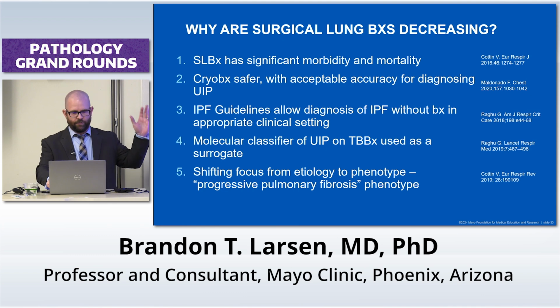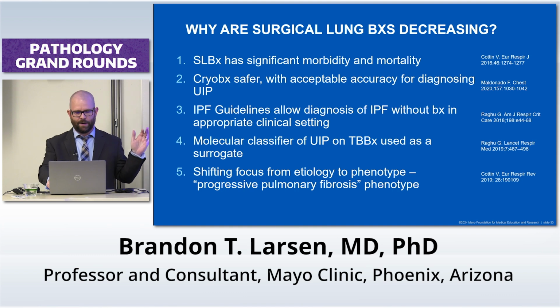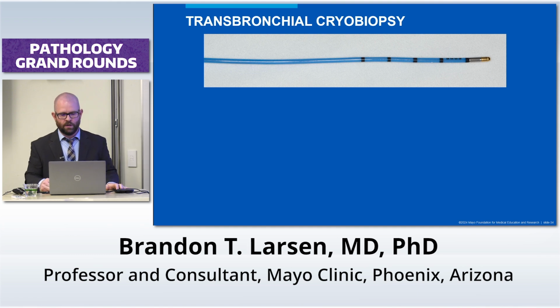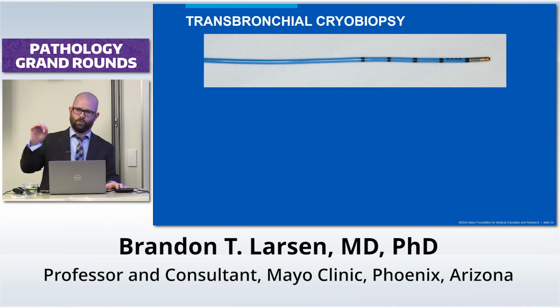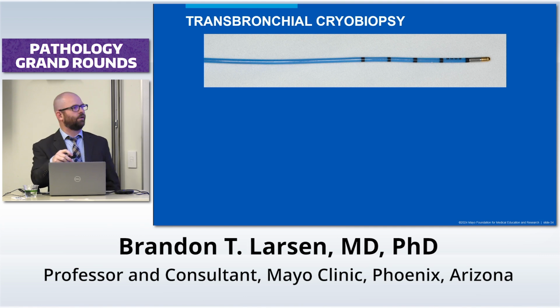So I want to talk about a few of these. I'm not going to talk anymore about the risks of surgical lung biopsy, but just for those who don't know what a transbronchial cryobiopsy is, I'll just briefly share this with you. As opposed to a transbronchial forceps biopsy where a bioptome is introduced through the working channel of a bronchoscope and then little pieces of lung tissue are taken from an endobronchial location, a transbronchial cryobiopsy has a cryoprobe introduced into the bronchoscope that has a special tip on the end of the probe, which can be made freezing cold when the operator turns it on, this metallic tip.